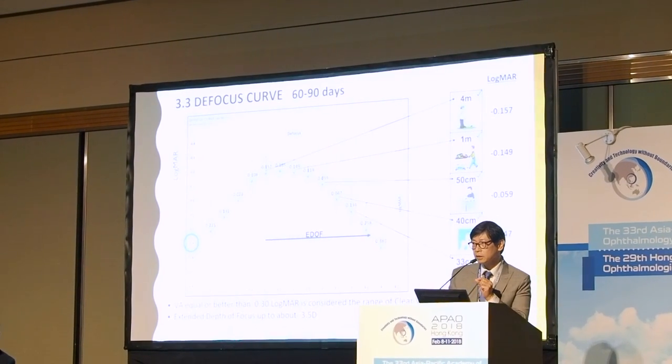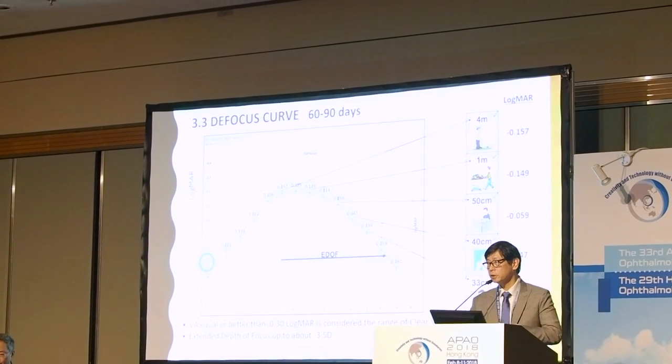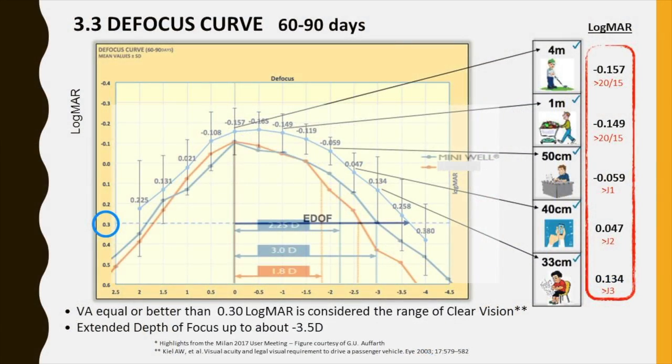Let me just spend slightly more time on the defocus curve as Chris did. The defocus curve is an objective measurement, and it allows us to compare different lenses to each other on a level playing field, because you correct for distance and you get the best vision with the best correction for distance. And therefore, you're leveling the playing field for all of these lenses. You are eliminating surgical variability, or residual refractive error, or even errors in biometry. So basically, you're testing the lens itself.